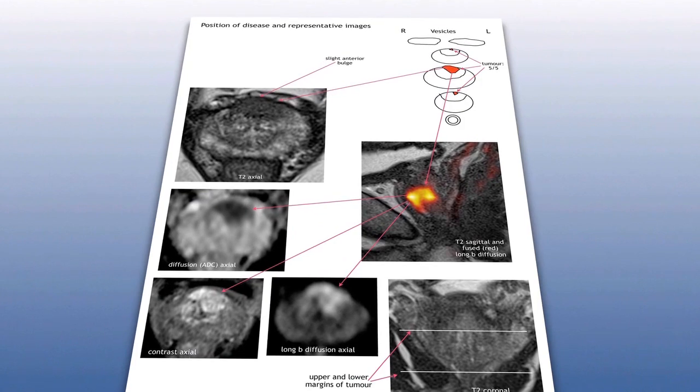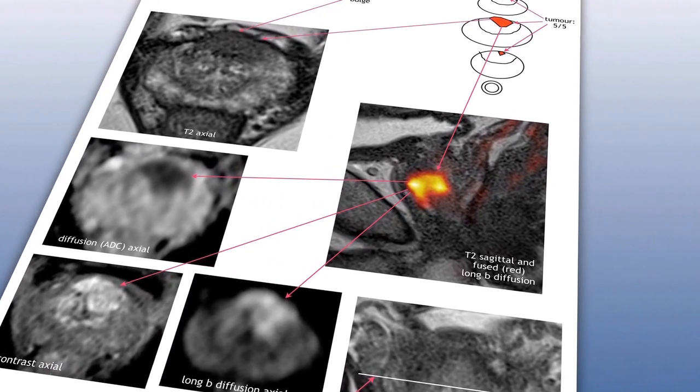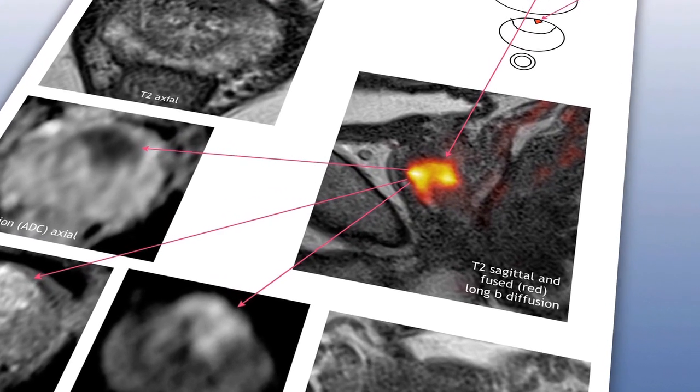For 5 years now on the NHS, we have had access to MRIs on the patients, and we actually get them up on screen and we discuss these with the patients watching it. And the patients get it straight away. They can see what a prostate is, they can see what the cancer is, and then you have a rational discussion about whether to sample it or not, whether to survey it or not, whether to treat it or not.